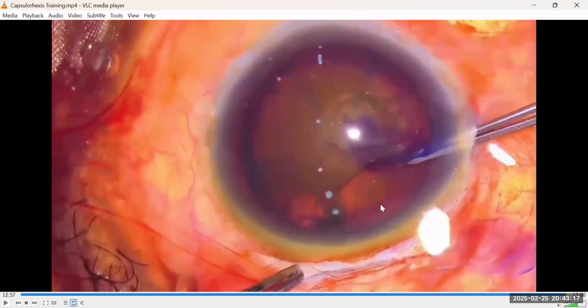Even when I started pulling towards the center, I was looking at it as it was tearing. If the tear becomes beyond me, I'll just go with a sharp pull towards the center. Just a sharp pull, and it will be rescued back.